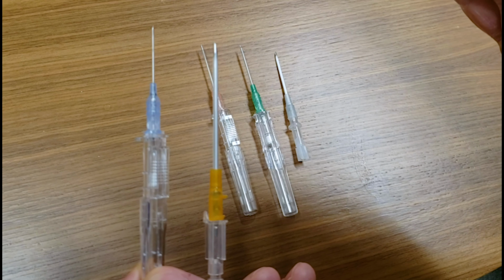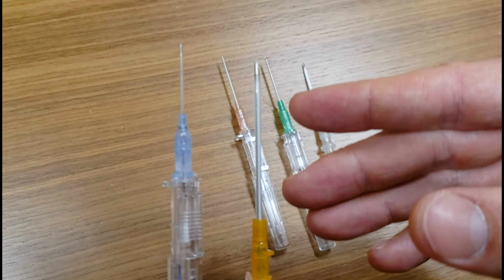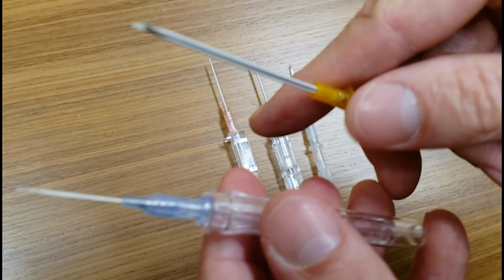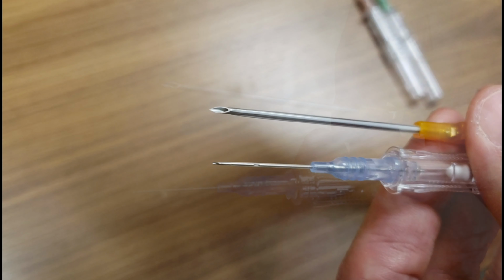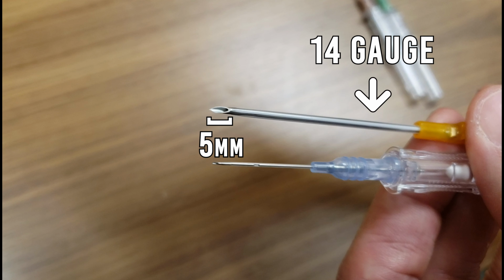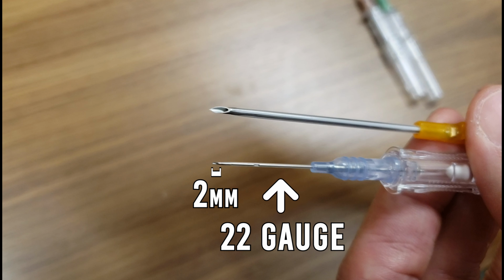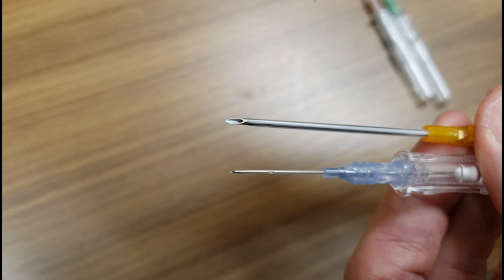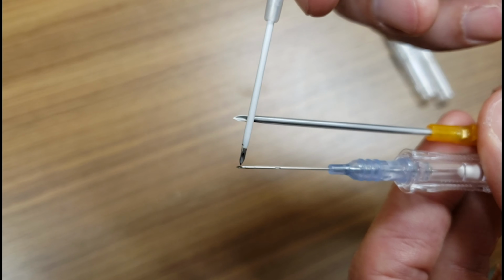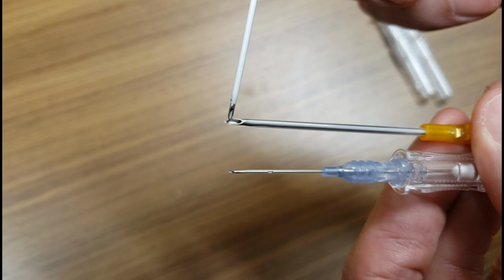But in terms of placing the IVs, what I want to bring your attention to is this major difference. In addition to the sizes, take a look at the size of the bevels. The bevels are much different in size. My 14 gauge IV has about a 5 millimeter bevel, whereas the 22 only has about a 2 millimeter bevel. So what does that mean for me? When am I going to get flash in my chamber? I'm going to get flash in my chamber when only 1 millimeter of the bevel is in.